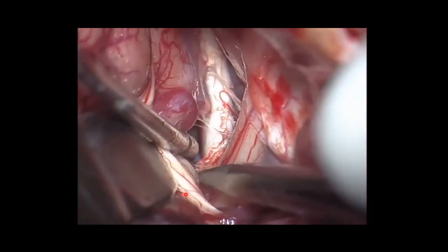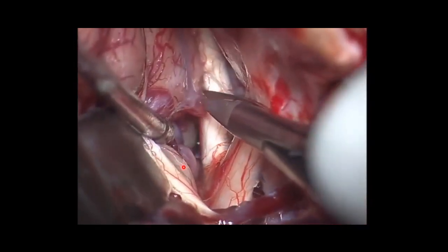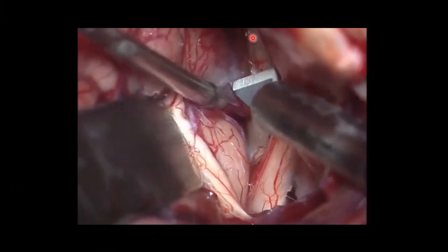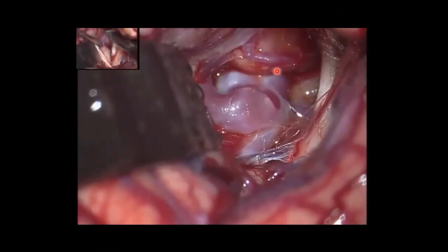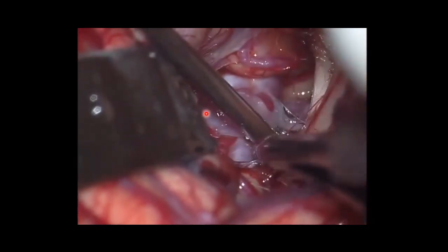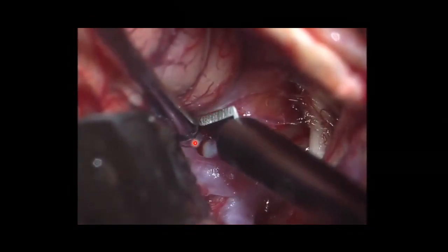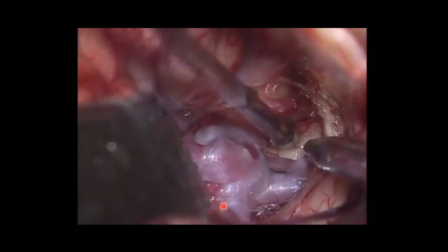This is the region of the lamina terminalis. This is olfactory tract. This is rectus gyrus. And now he's opening the interhemispheric fissure. By doing this, it will be much easier to retract the rectus gyrus. Now rectus gyrus under the spatula. And this is A2 from the right side. This is the A1, right A1.